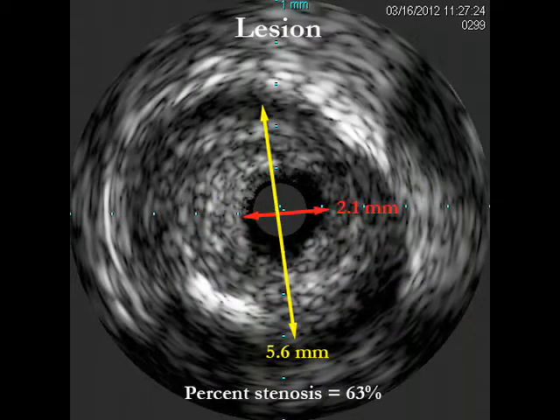Next, the recording is scrolled proximally to the lesion of interest where the measurements of vessel and lumen diameter and vessel and lumen area are measured and percent diameter and/or area stenosis is calculated. In this segment of vessel, the percent stenosis represents extensive atherosclerotic plaque buildup.